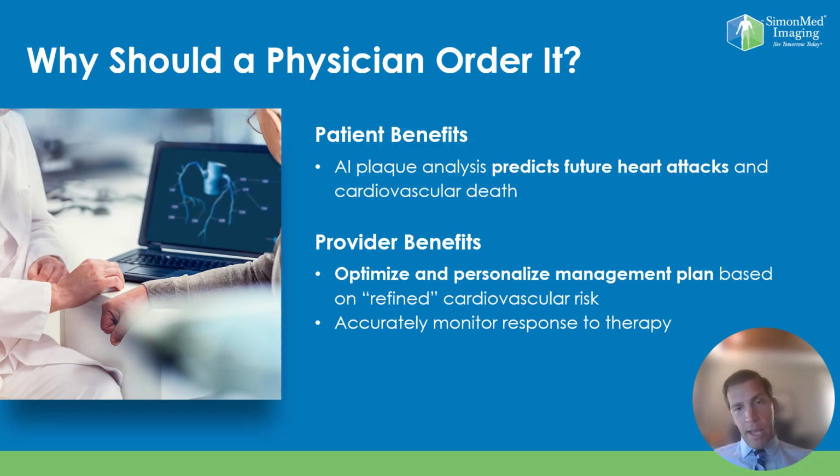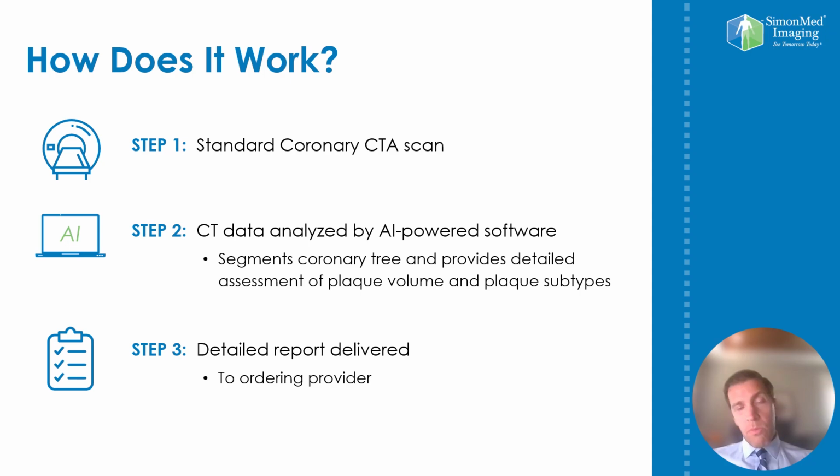Optimizing and personalizing your management is really our goal here. And so with this additional data, your provider can put you on the appropriate management plan to ultimately prevent you from having a future heart attack or stroke. They can also monitor your response to therapy over time. Because this data is quantitative and we get volumetric measurements of plaque, we can actually track it over time to determine, is the medication working or is it not working?